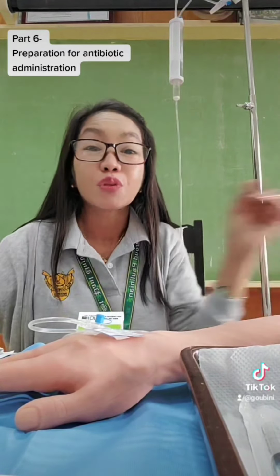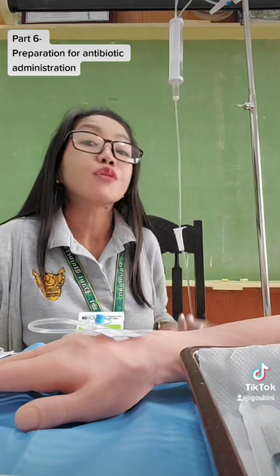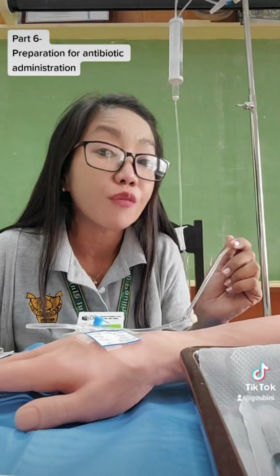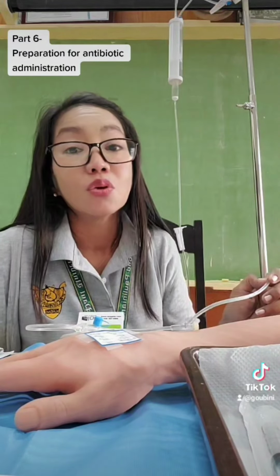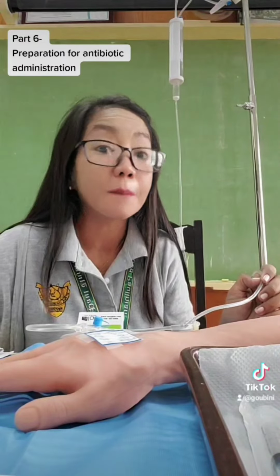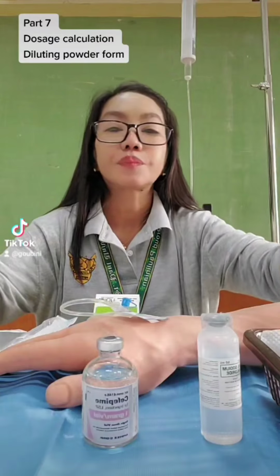Because this is through IV infusion, you have a responsibility. You have to make sure that these IV lines are free of air bubbles. Air bubbles can travel in the circulation of your patient, and thus can cause emboli or embolism.